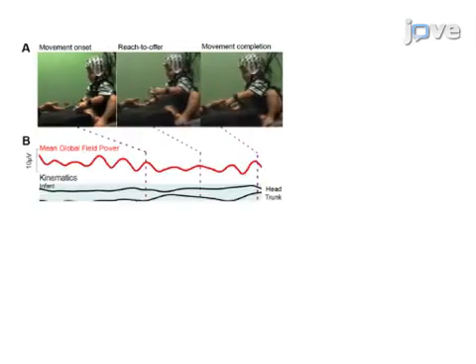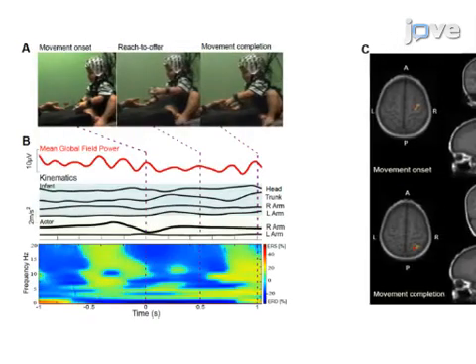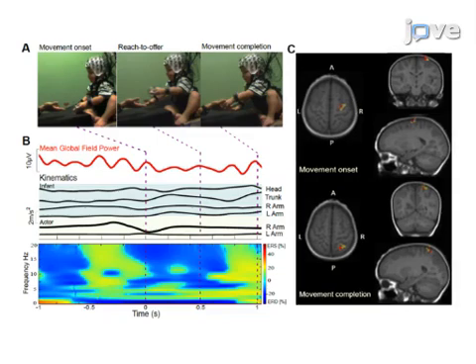Ultimately, the acquisition of EEG and kinematic data from freely behaving infants allows the investigation of the neural basis of cognitive motor development and the emergence of social cognition.